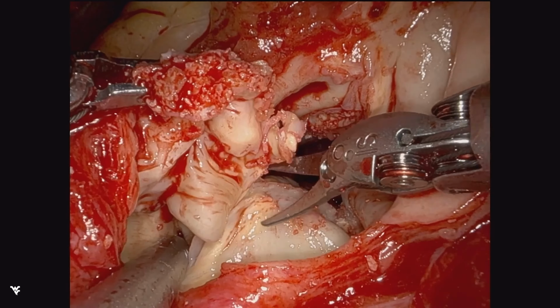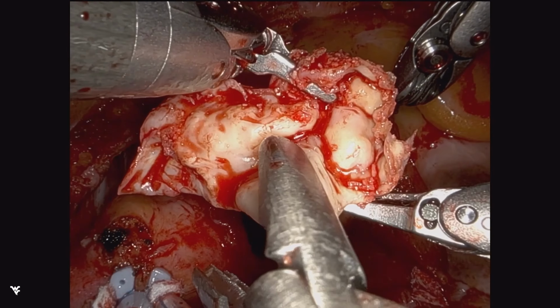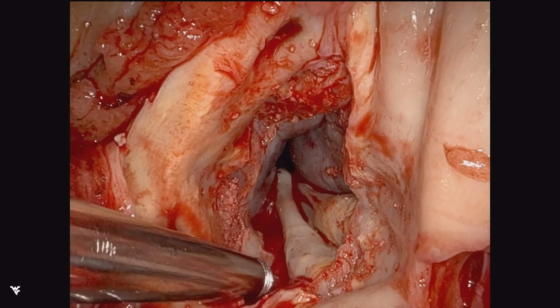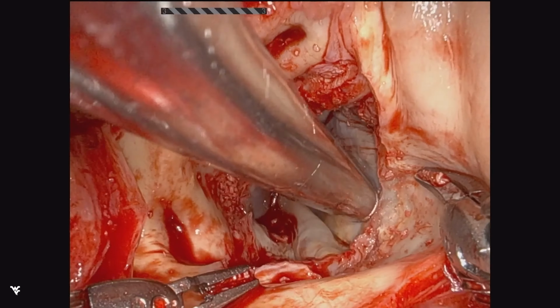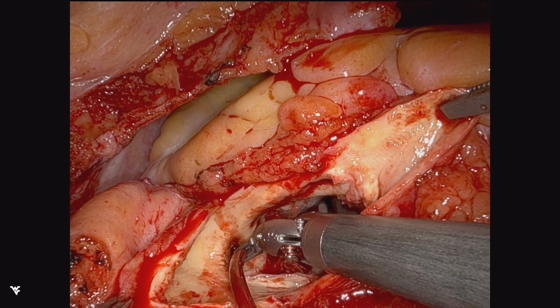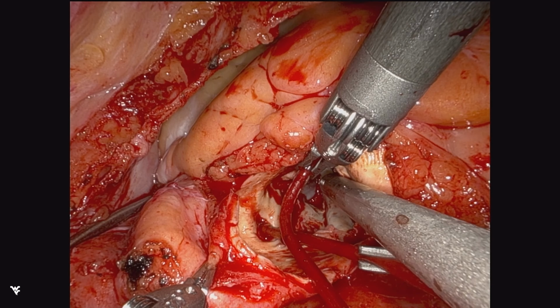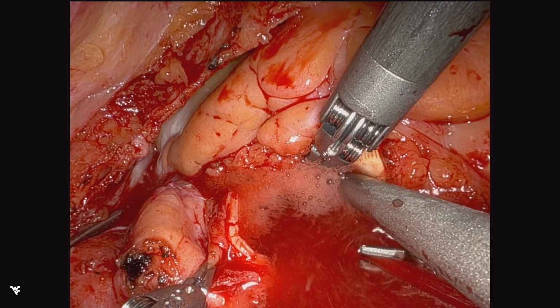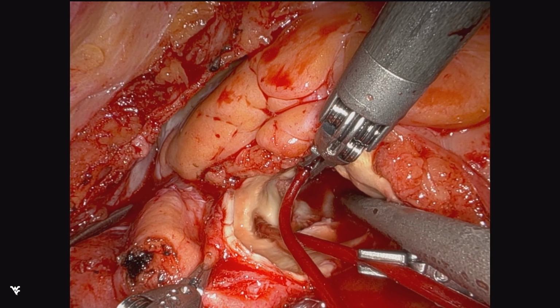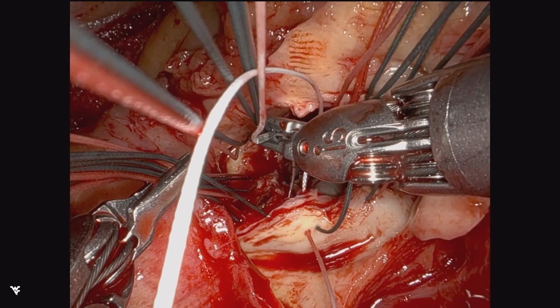And we get a nice flush debridement. And now we go after every morsel of calcium with suction and aspiration and irrigation, working together as a team. We would posit that this is one of the reasons why we feel that through robotic, our stroke rate is exceedingly low, if not near zero, compared to open surgical cases in calcific disease, because we're able to visualize every aspect of any type of particulate matter.